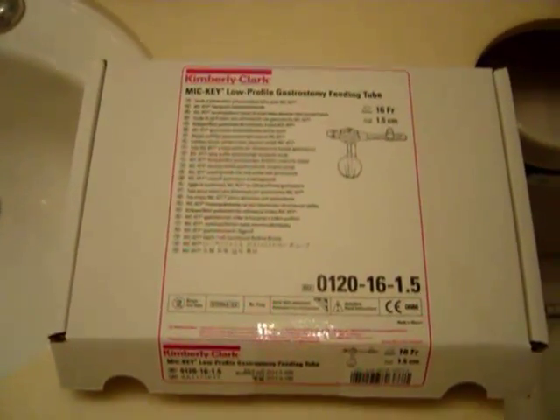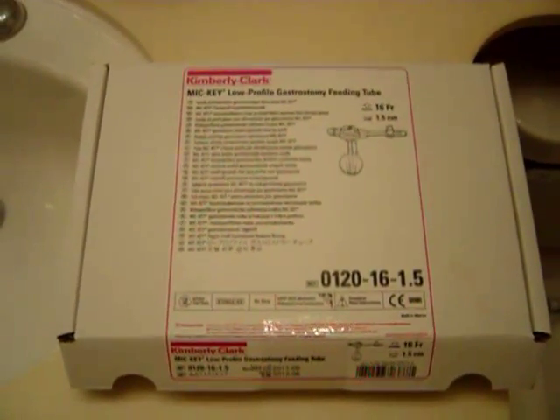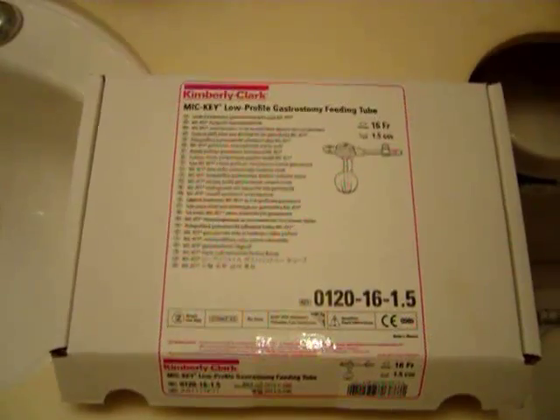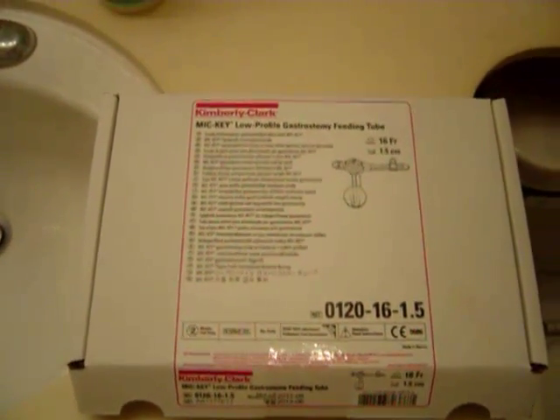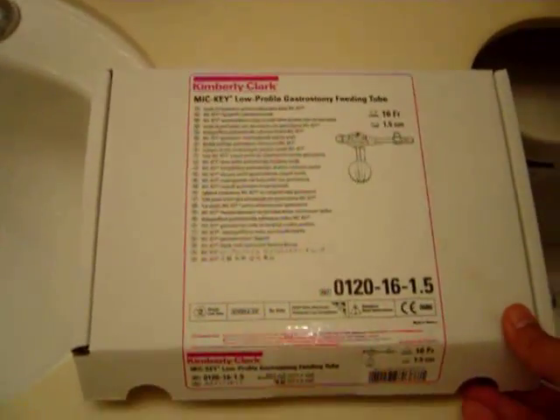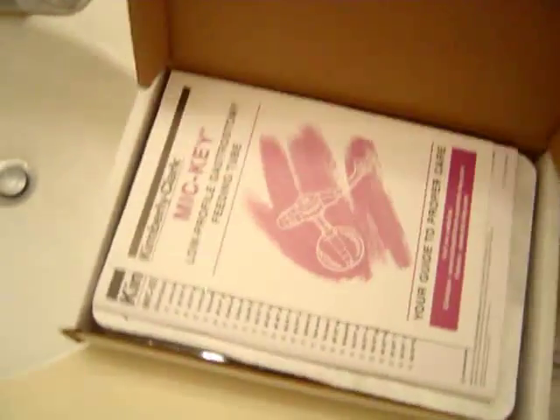This is a Mickey low-profile g-tube and it's kind of different compared to a lot of the other g-tubes out there. I just wanted to post a quick video on this to make sure that everybody sees it. I like it — it's kind of a no-mess g-tube and it's starting to become more popular. The first time I saw one was in North Carolina and I've been seeing them a lot more recently here in California.